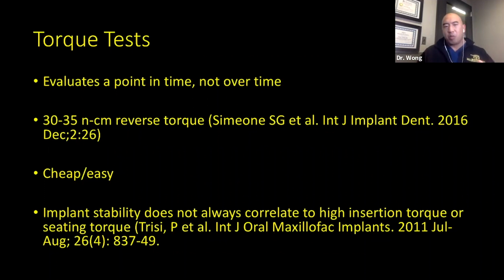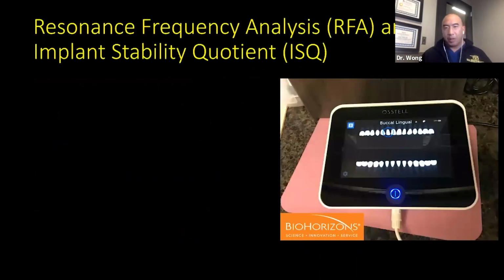And then, of course, I always remind people that implant stability does not always correlate to high insertion torque, or to the seating torque when you're putting your implant in. For those of us doing a lot of immediate implants and immediate loading, I always remind you, high insertion torque does not necessarily equate to implant stability. But what does? That's our next topic.